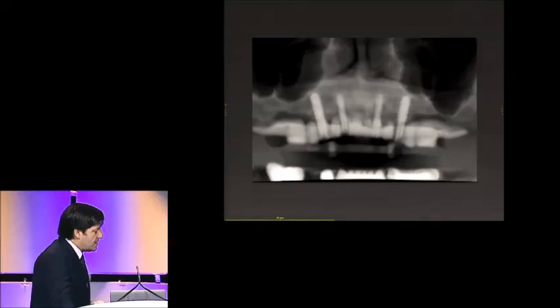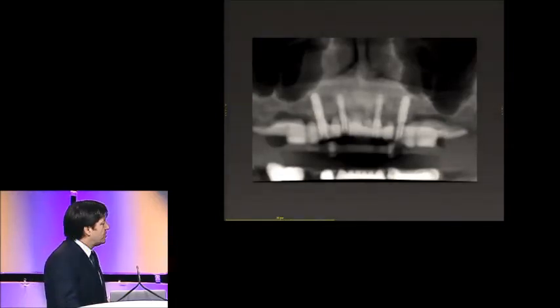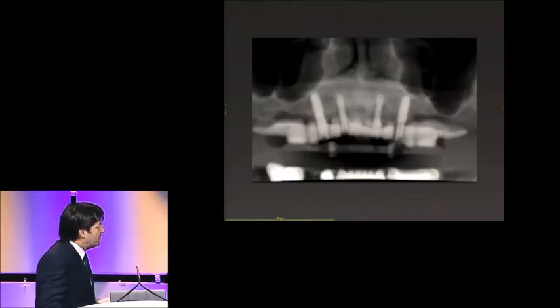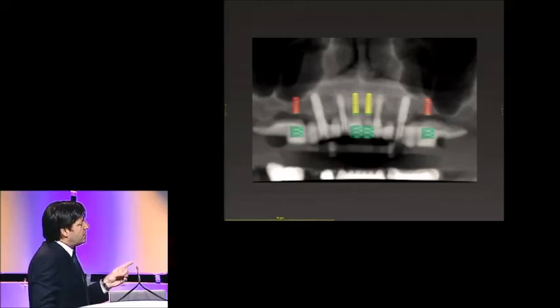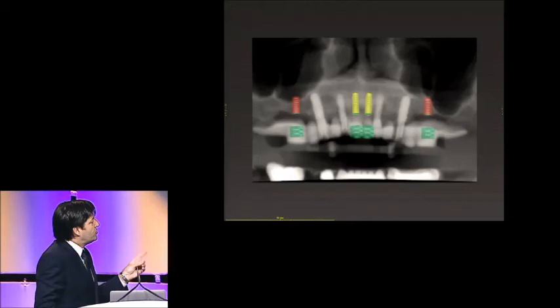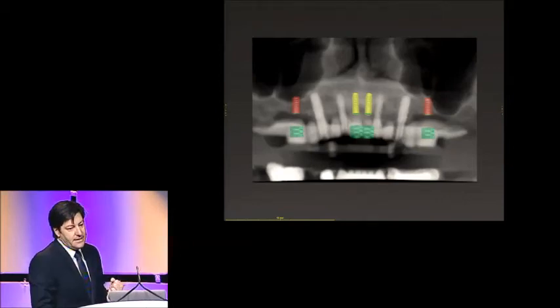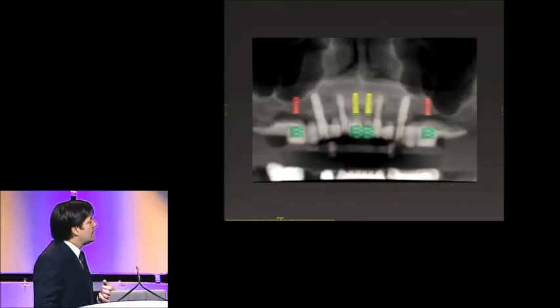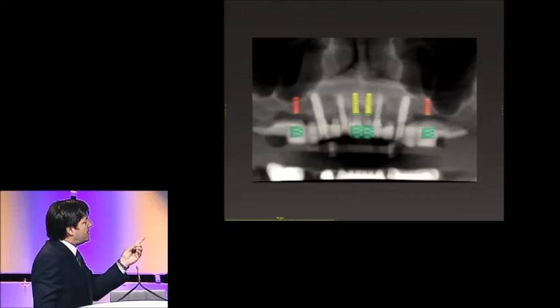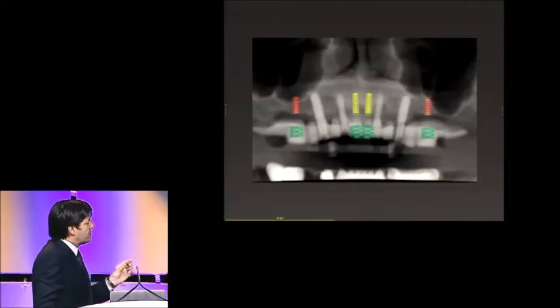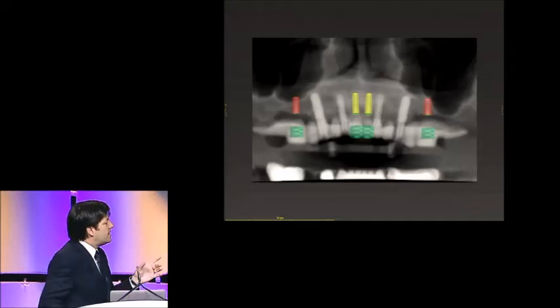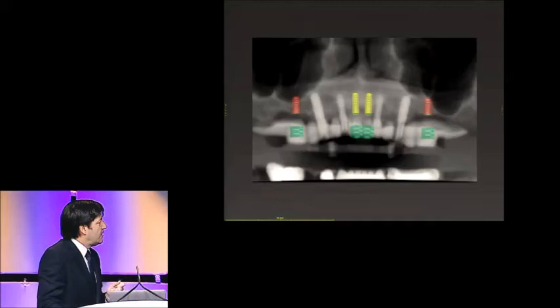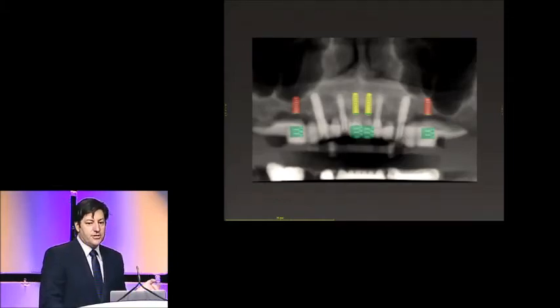This is the cone beam CT. You can see on the screen that the two anterior implants show notable bone loss. The plan for today is as follows: Dr. Roussaint will place two additional implants in the central incisor area and two additional implants in the first molar area, with the intention of later removing the implants on positions 7 and 10, as these implants cannot stay in the patient's mouth. Due to the large size of the ridge, Dr. Roussaint will attempt a flapless approach, and will also perform a transalveolar sinus augmentation in the upper right, position number three — all within the next hour.